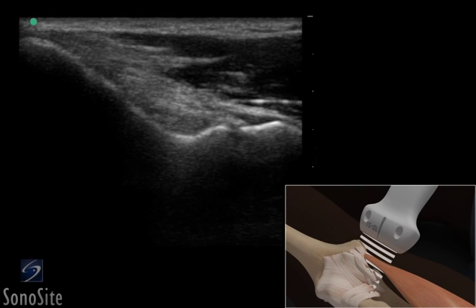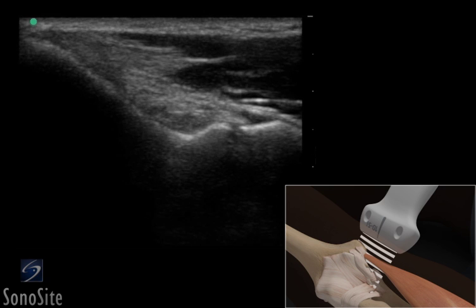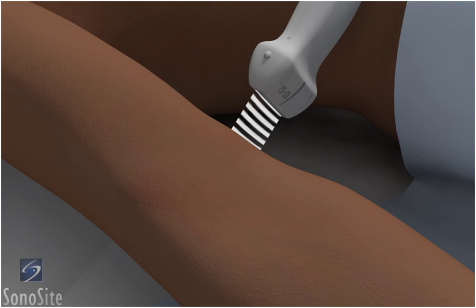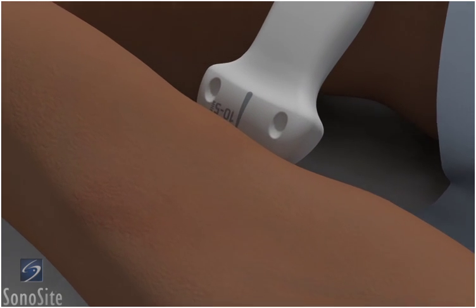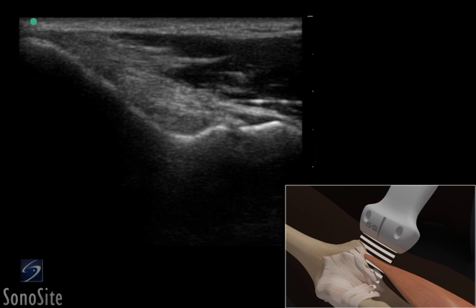A linear array transducer with a musculoskeletal exam type is used to perform an ultrasound examination of the medial elbow. The patient is placed in a supine position with the elbow slightly flexed and the forearm forcefully externally rotated and resting on the examination table. The transducer is placed over the medial epicondyle in a longitudinal fashion with the orientation marker directed toward the patient's head.